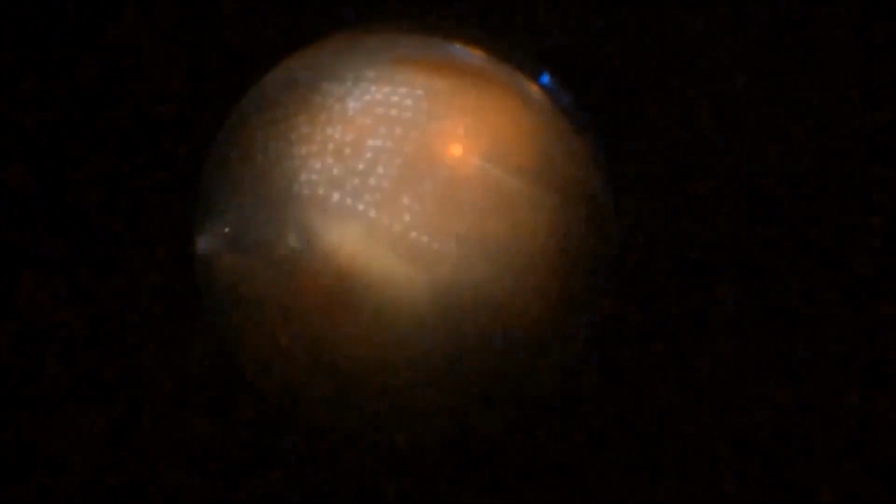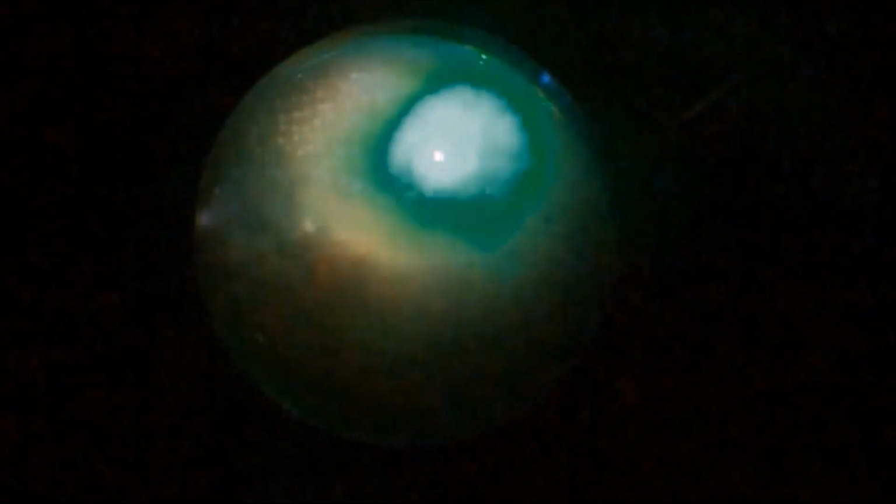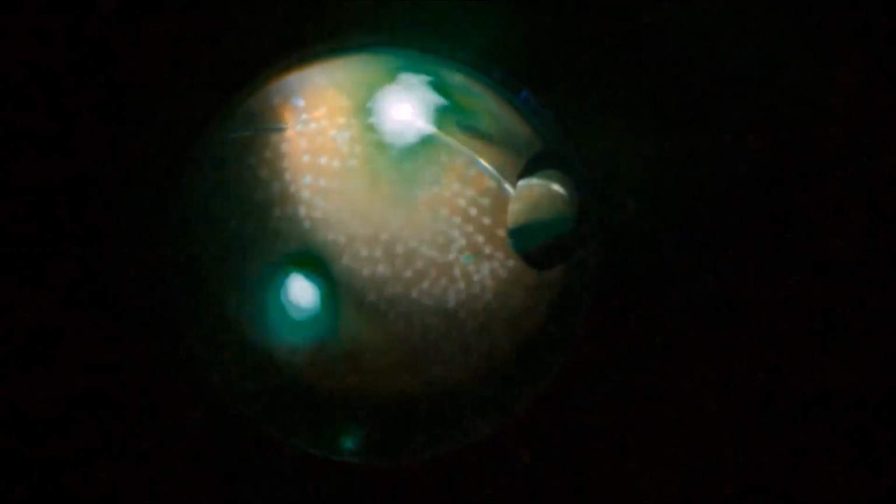This was followed by pan-retinal photocoagulation in the peripheral attached retina. It is very important to remove such membranes by gentle tangential traction to avoid the formation of any breaks.